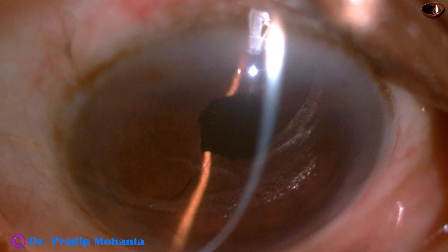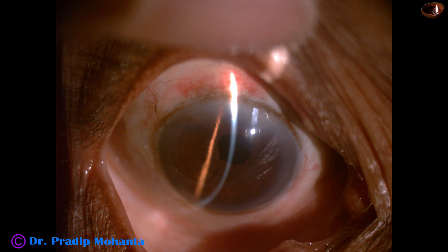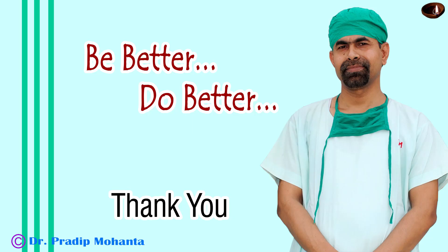There is very mild Descemet's membrane folds here and there. The pupil is a little distorted because of the application of iris hooks. The anterior chamber is quiet. Visual acuity is 6/12 with optical correction and it will improve further when the Descemet's membrane folds resolve. Thank you very much for your attention. Hope this video will help you in developing your surgical skills. Be a great surgeon and serve your patients with love, respect, empathy and great surgical competence.